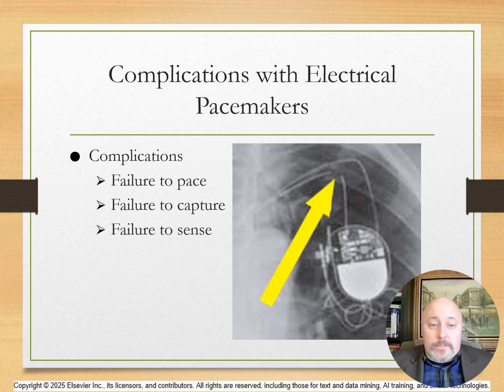Other causes could include battery failure, fracture of the pacemaker wire, or increased pacing threshold as a result of medication or electrolyte imbalances. Adjusting the output if the patient has a temporary pacemaker and placing the patient on his or her left side are nursing interventions to help treat this failure to capture. Turning the patient onto the left side facilitates contact of the transvenous pacing wire with the endocardium and septum.